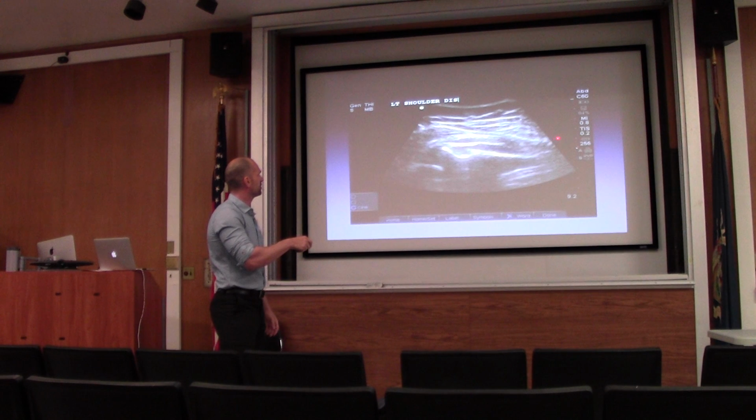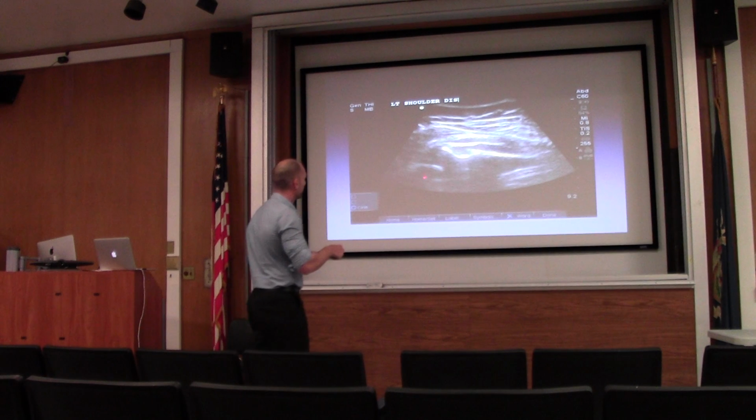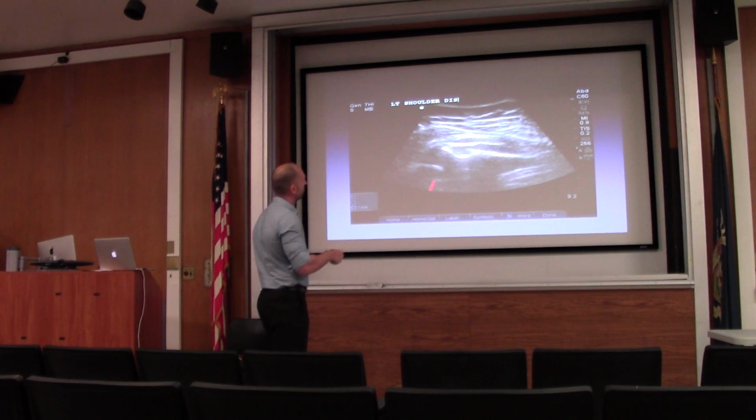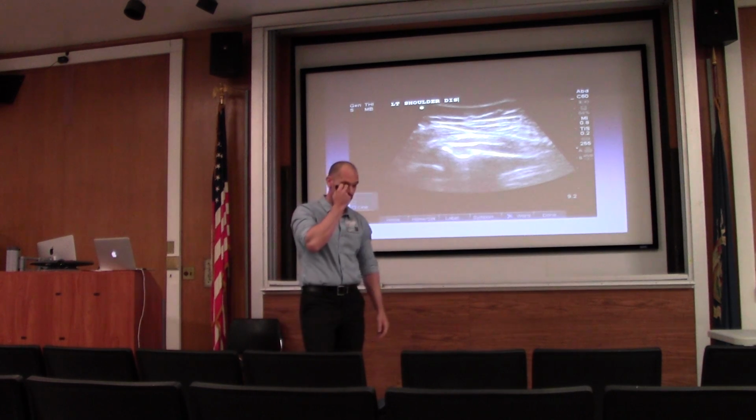And then if you still hold true to that thing that I was telling you about with the infraspinatus tendon, follow that bright white line, and here it goes down, and it just falls off a cliff. That's another way that you can help yourself find where your humeral head is, because I find these to be a little bit difficult.